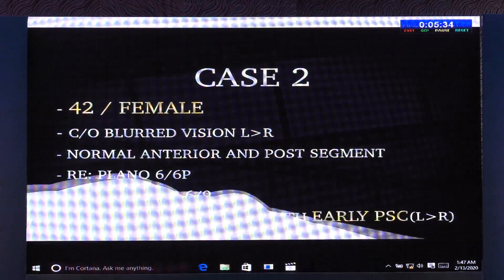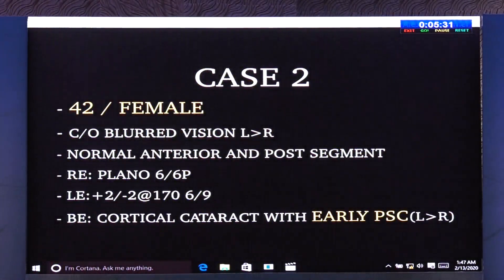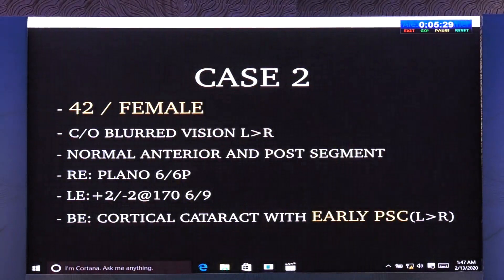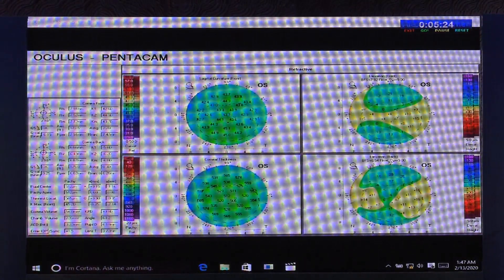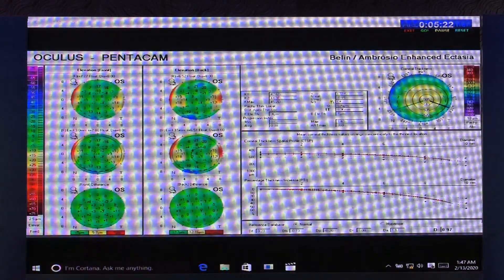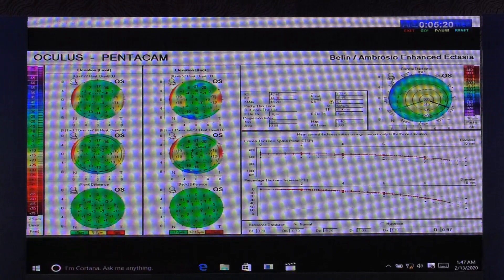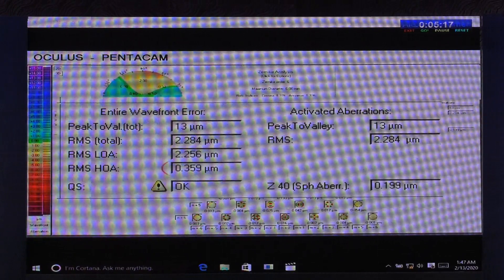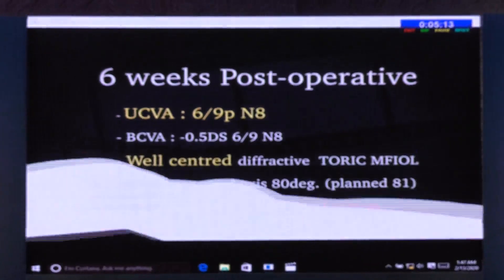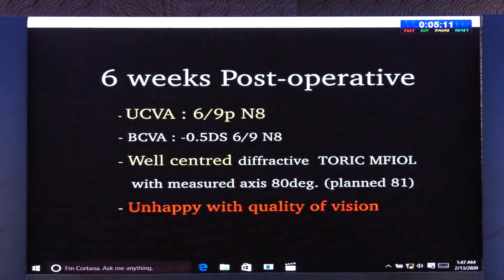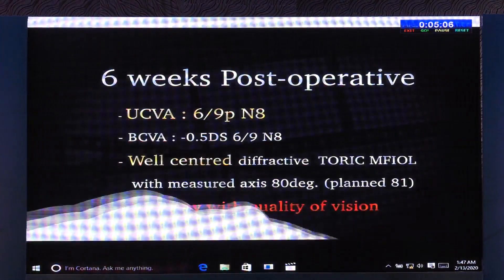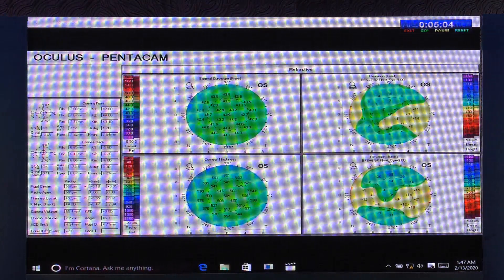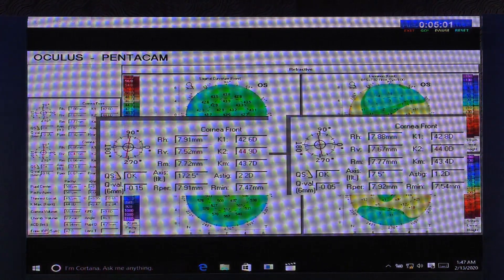Here is a case of a 42-year-old female with a PSC cataract and –2 diopters of astigmatism. The topography showed with-the-rule astigmatism and no irregularity. But on seeing the aberrometry map, it showed higher HOA values. Post-operatively, the toric IOL was well-centered; however, the patient was still unhappy, with residual cylindrical astigmatism of 1.2 diopters.